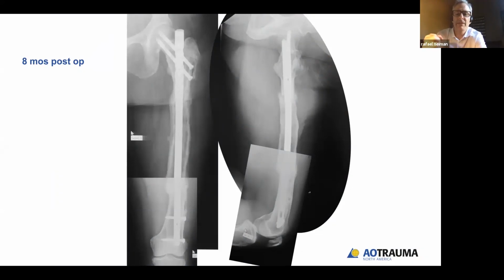So looking at the distal segment, I wanted to touch on a couple of points. Steve, the nail trajectory, where it ended up. What do you think? Looking at the nail trajectory in the final position, your first inclination would be to say that you have malaligned the distal segment. Although we know for a normal femur that that would be true with the nail on the side, we have to look a little closer when we're correcting a deformity, because sometimes for the bone to be straight, the nail doesn't end up in the spot it usually would for a normal femur. I think in this case, it's pretty close.